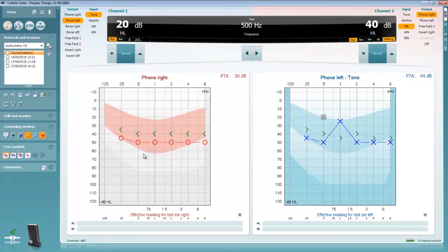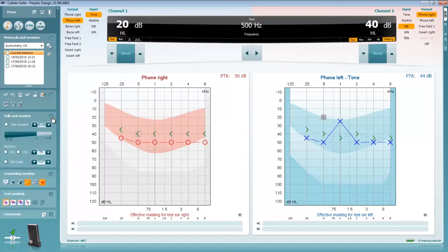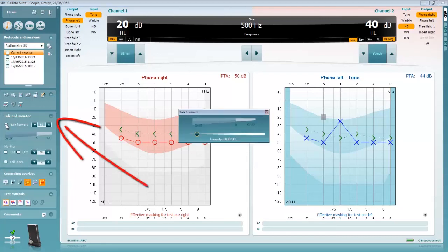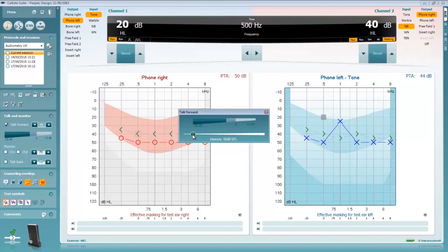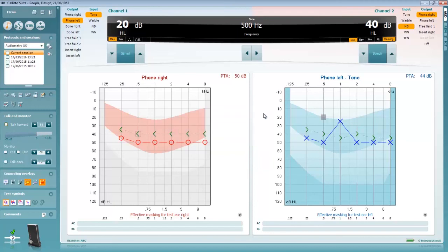Should you be operating in an environment where you're not sitting close to the patient when testing, for example when using a booth for audiometry, then you can use the talk backwards and talk forward function. To enable talk forward, please click on the talk forward icon. This feature is only enabled when it's clicked and will allow you to present your voice through the audiometric headset being used. This is useful when you need to re-instruct the patient on the test or for positive reinforcement.